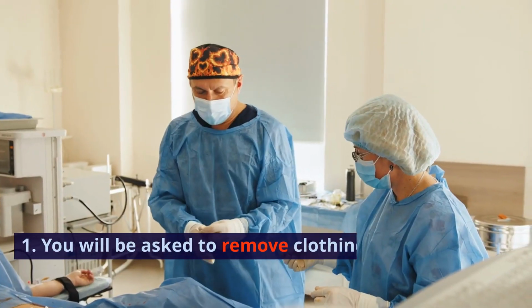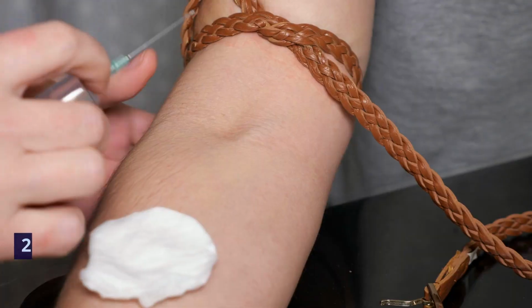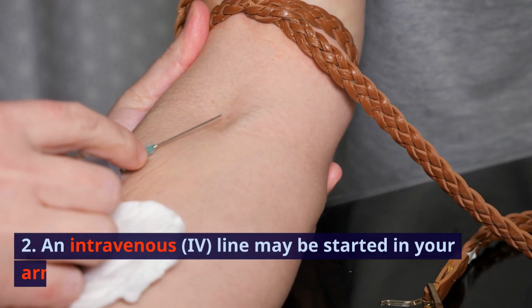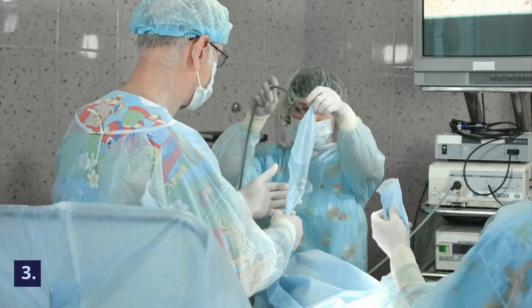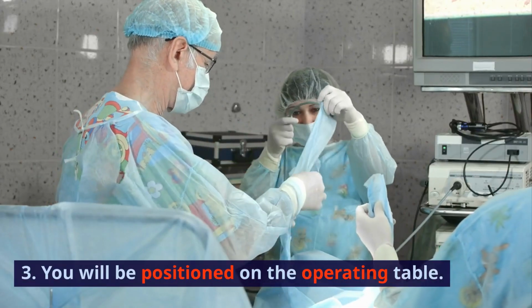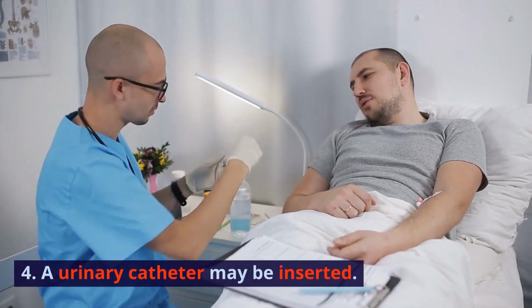1. You will be asked to remove clothing and will be given a gown to wear. 2. An intravenous line may be started in your arm or hand. 3. You will be positioned on the operating table. 4. A urinary catheter may be inserted. 5.